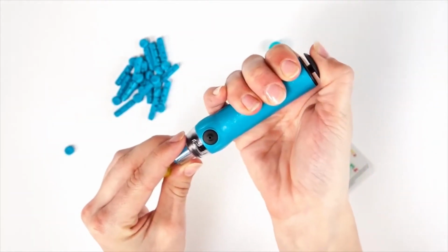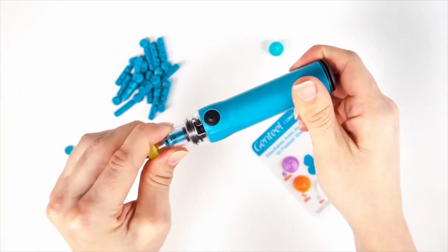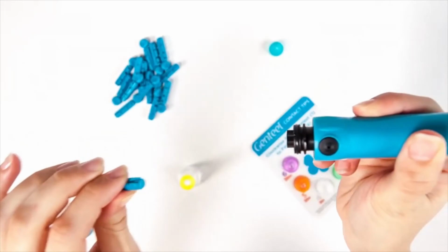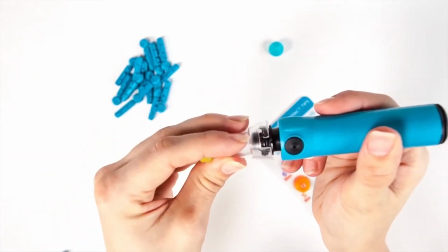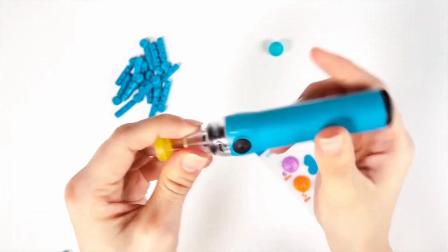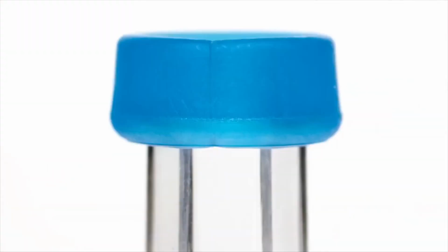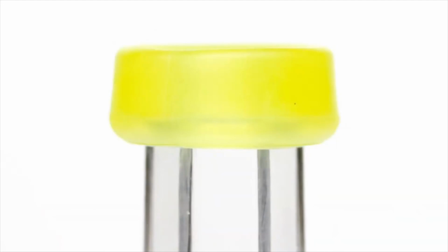To discard the lancet, twist the nozzle counterclockwise, pull off, and place aside. Remove the lancet and discard safely. Place the nozzle on Genteel. Twist clockwise and ensure it's secured for next use. Remember, if no blood was drawn, repeat these instructions with a deeper contact tip.